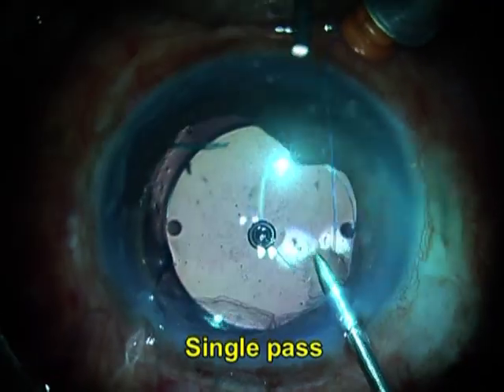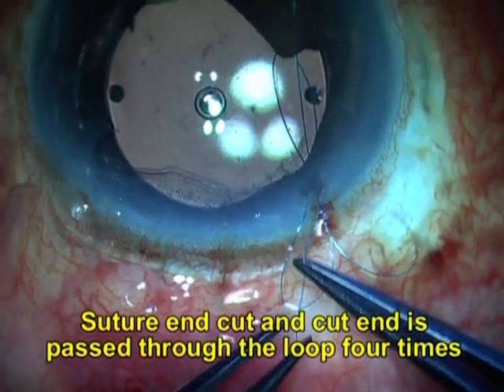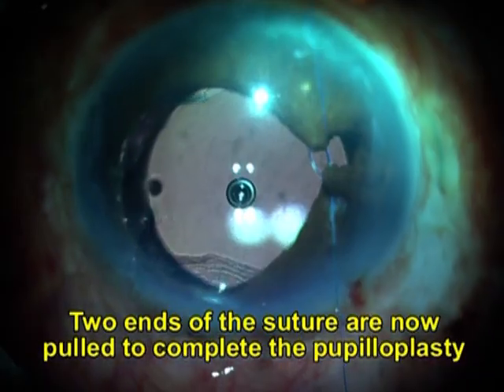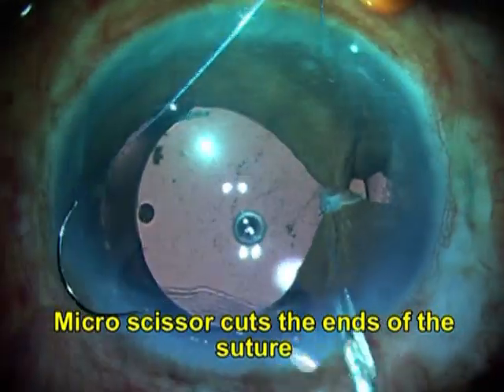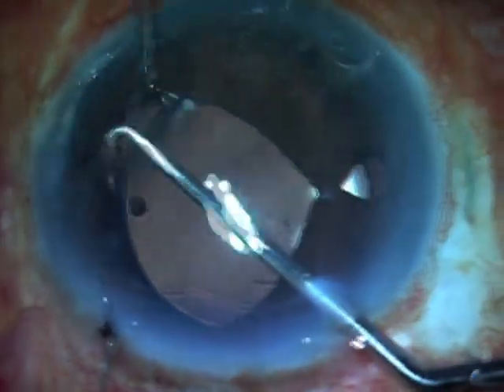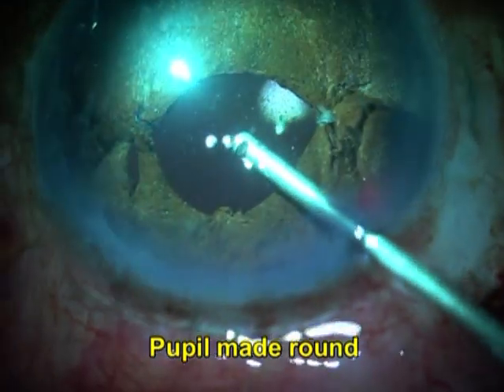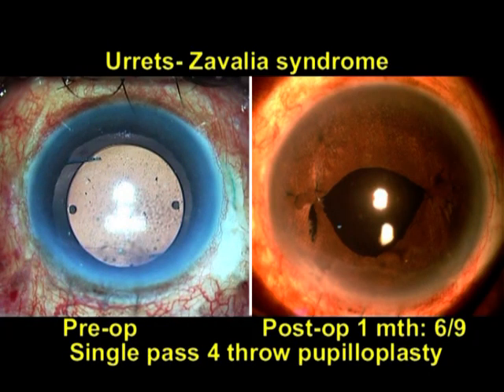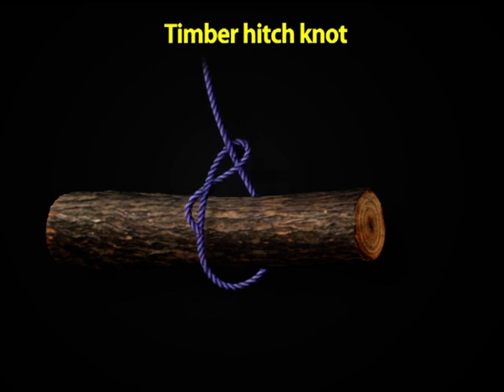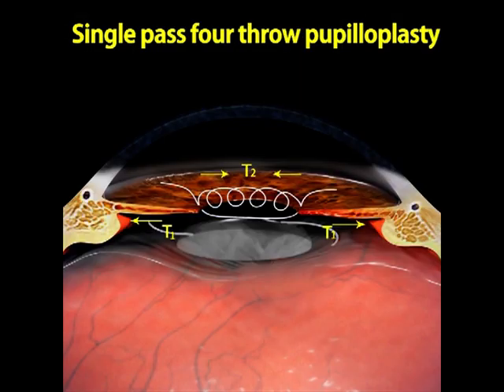In Urrets Zavalia syndrome, the patient usually complains of decreased vision, glare and halos. On examination, the pupils are detected to be fixed and dilated that do not respond to either miotics or mydriatics. Following the pupilloplasty, the pupil is brought back to normal size. Single-pass 4-throw pupilloplasty bears a close resemblance to the timber hitch knot. The 4-throw holds as T2 is greater than T1.